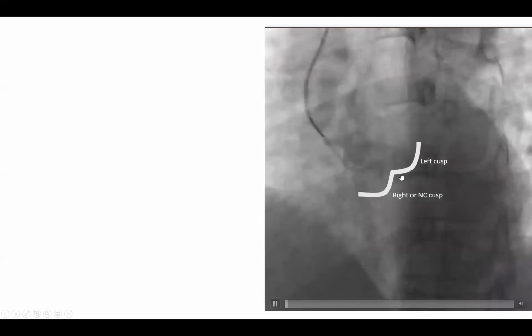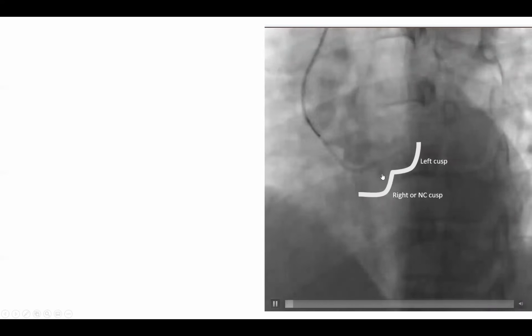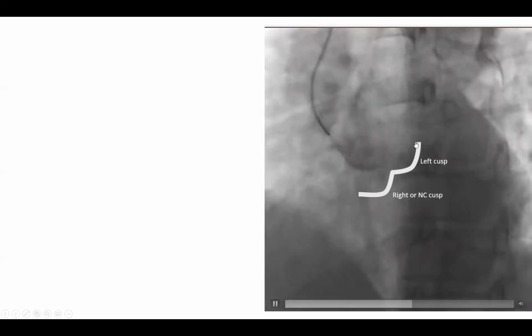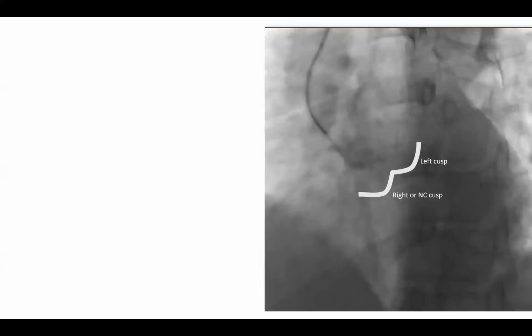And you see, this is a simple illustration. You need to get that jump in your brain. Watch it again. See, this is a jump. You need to recognize it. When it jumps, you know you got to the left cusp, okay? See here.